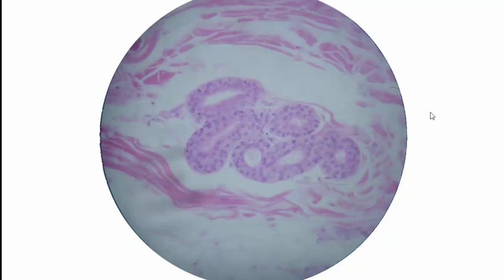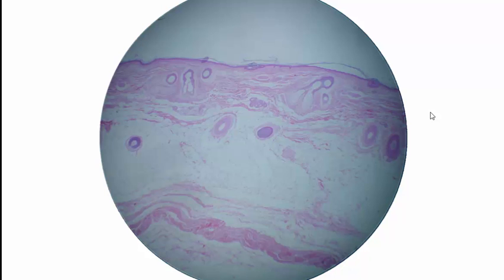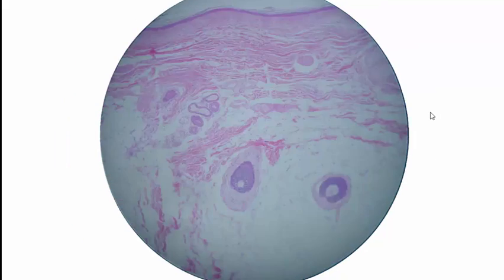Oh, I forgot, my intention here was to ask my students, because this is a slide they haven't seen in the lab, at least not yet, but even though this looks so much different, you should be able to identify the three major layers of skin. What's this outermost one? The answer is epidermis. What's this one? Dermis.